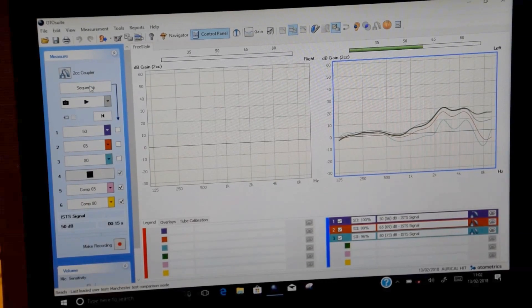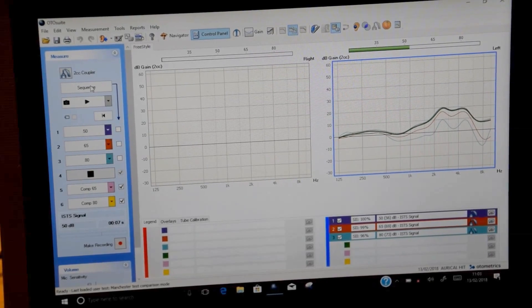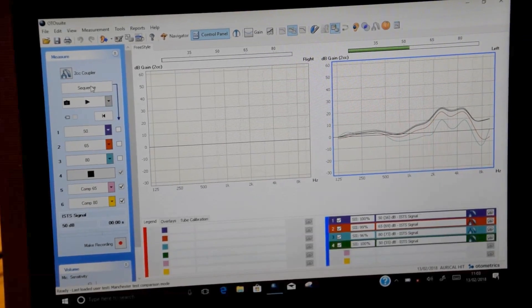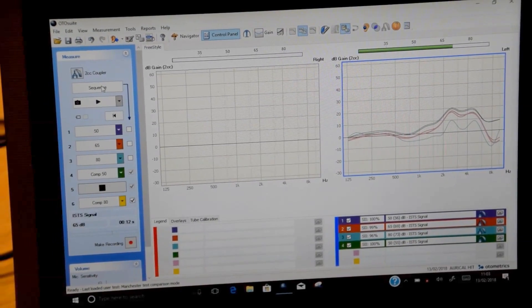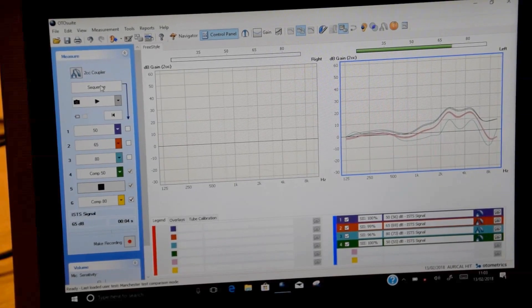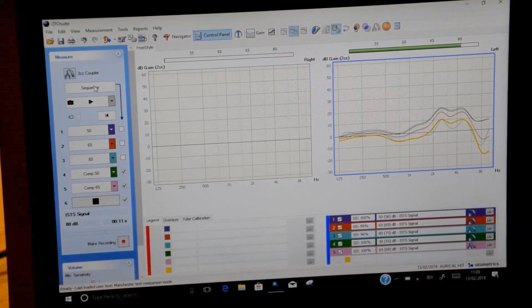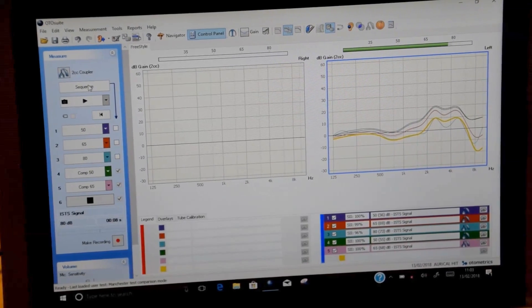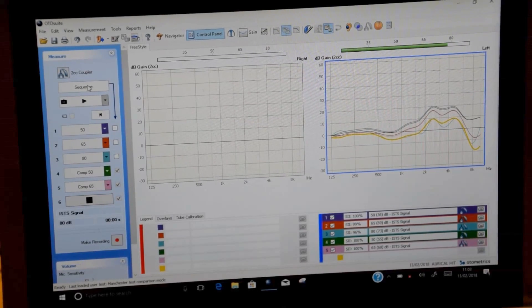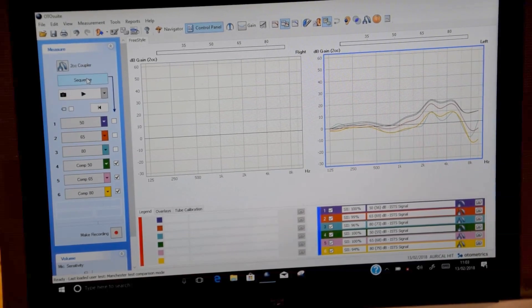So we now press Sequence. The curves are overlapping each other, so we know that the hearing aid is performing the way it was when we first tested it.